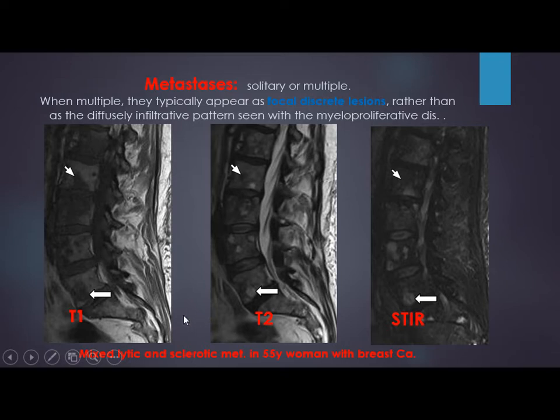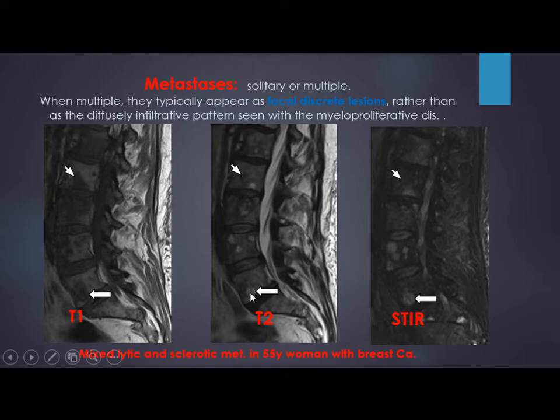This patient is a 55-year-old with metastatic breast cancer, showing both types of metastasis — since breast cancer can cause both lytic and osteoblastic metastasis. On T1, T2, and STIR: low signal on T1 and high signal on T2 represents lytic metastasis, highlighted on STIR. While low on T1, low on T2, and low on STIR represents osteoblastic metastasis — osteoblastic lesions appear low on all sequences.